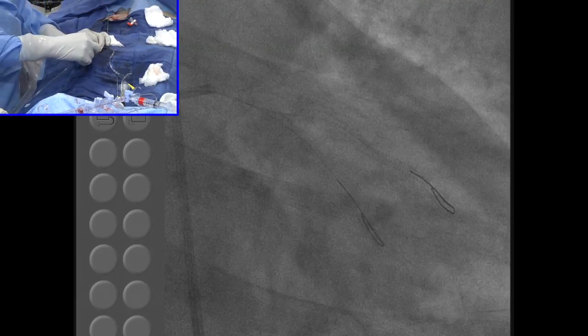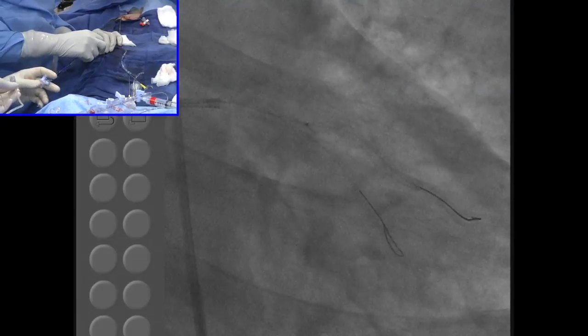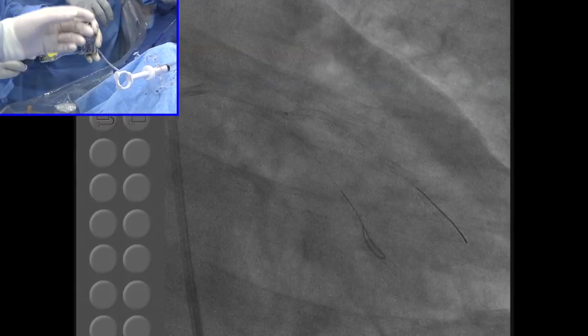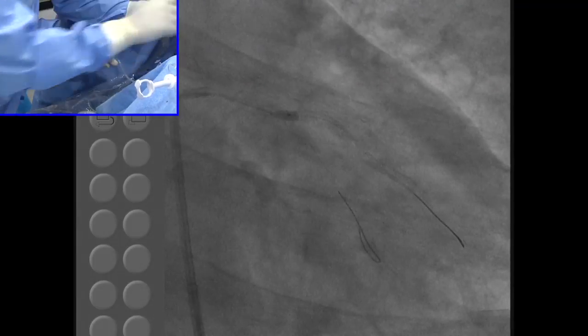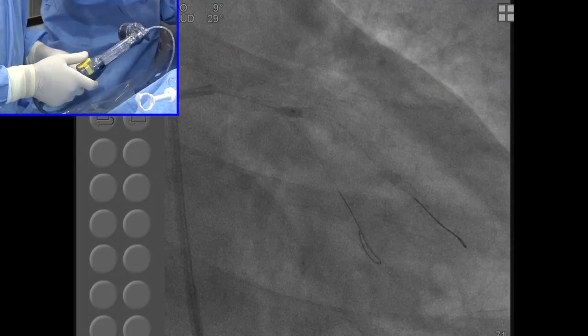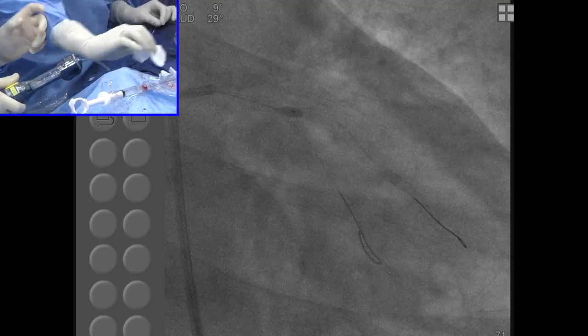We have a 2.0 by 8. All right, maintain. That's it. Don't go beyond. 2.5, right? Yeah. Good. So the compliant balloon, 2.0 or 2.2, what size was that earlier? 2.5. That did not go and the Glider went down. Get us a 2.75. No, but you have to cine this so that people can see. 4 millimeter, very short balloon.